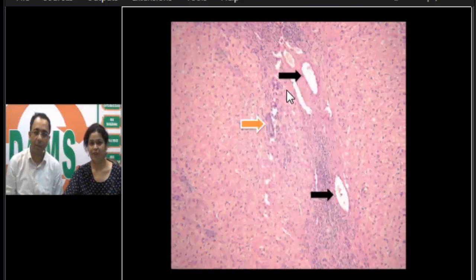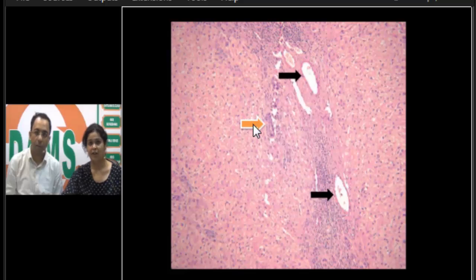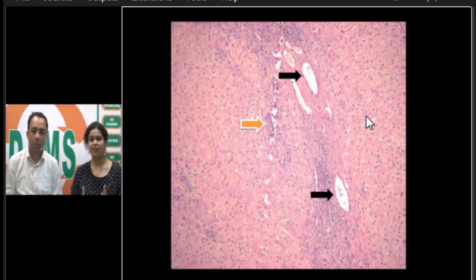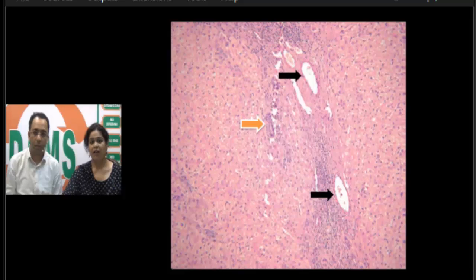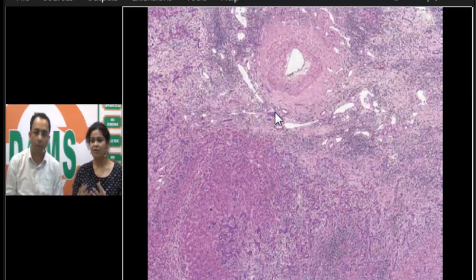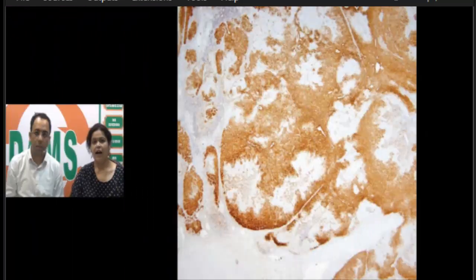On microscopy, in the center there is a fibrous septum with lots of small blue dots — these are lymphocytes, indicating a dense inflammatory response. In the center, marked in black, you can see vessels, and marked in red is a ductular proliferation, which is very characteristic of FNH. On either side there is hepatocyte proliferation, though not as pronounced as in a neoplastic process. On IHC, a thick-walled blood vessel is visible, indicating the vascularity centered in the central scar.